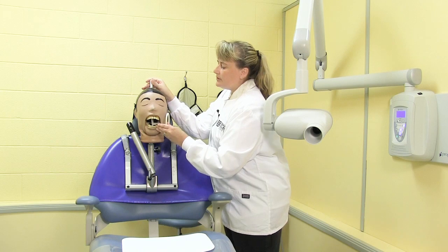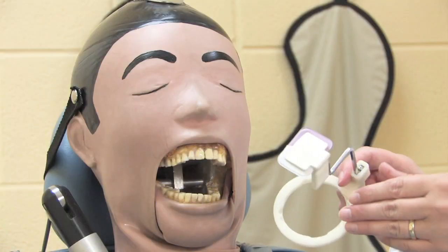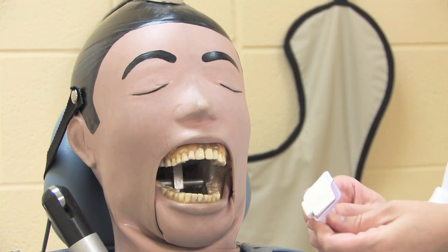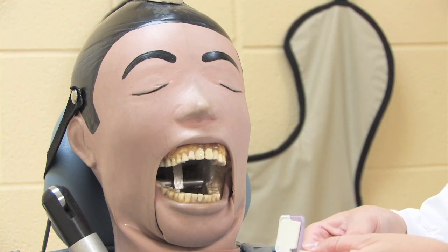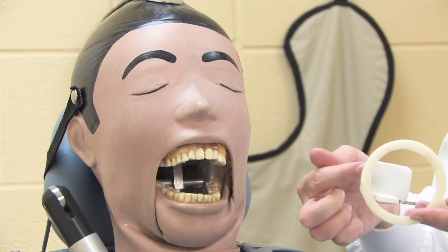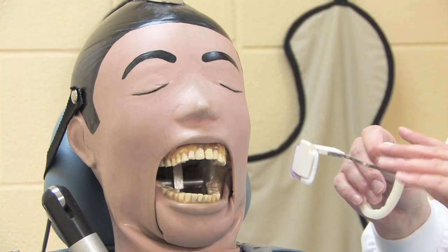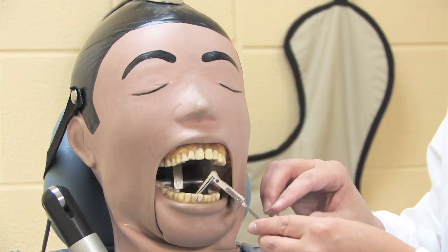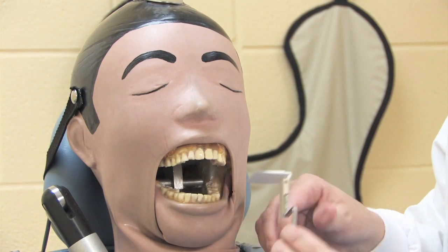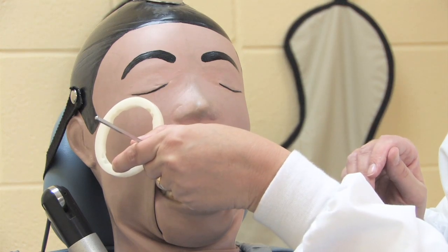For the mandible, staying on the left side of the client, I do need to change the instrument. I'm going to remove the rod, place it on the other side of the block, and also adjust the ring. Again, so the film is in the center of the ring. I'm now ready to do the 3rd quadrant, or the client's lower left, or the first quadrant, the client's upper right.